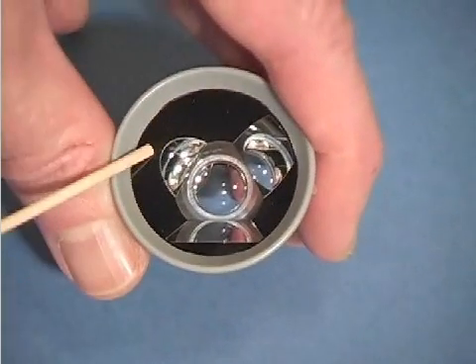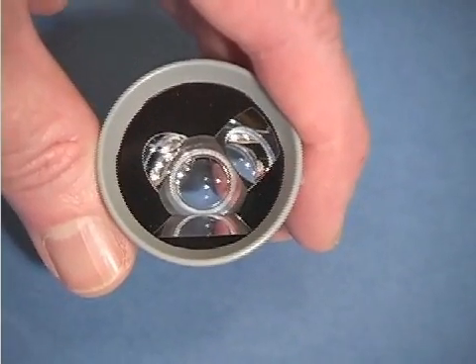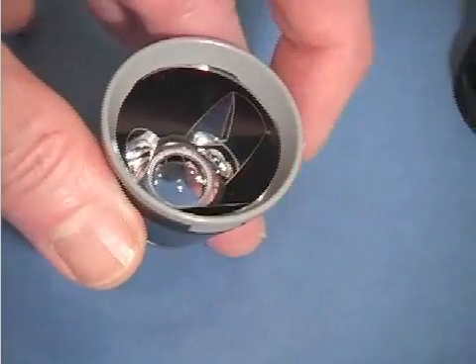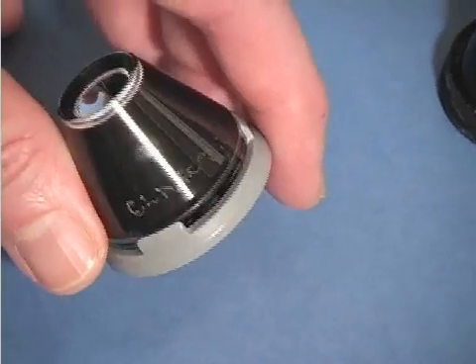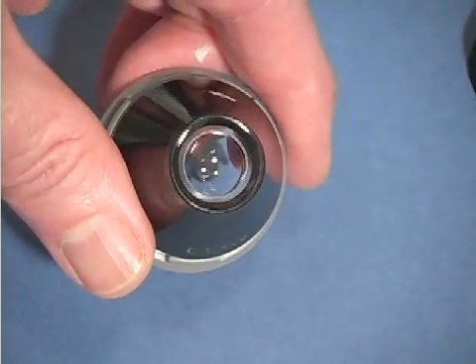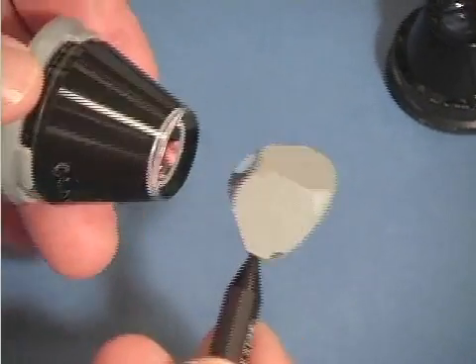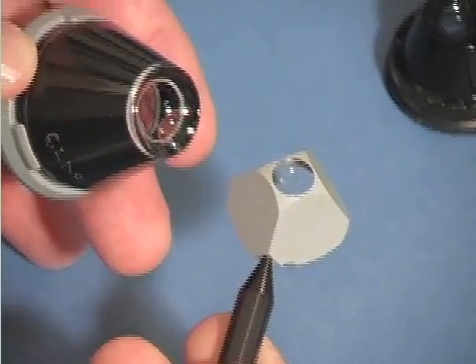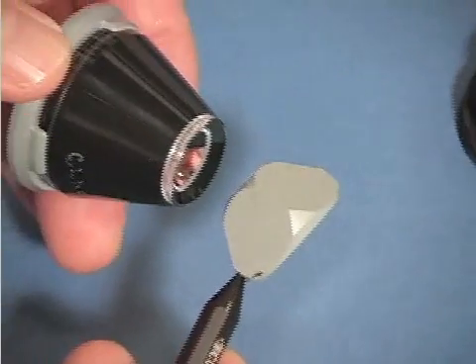This section will discuss the Goldman lens and variations of this lens, such as the MagnaVue lens, the Rich lens, etc. These lenses provide a beautiful view of the iridocorneal angle. They have a large area of contact and vault over the cornea. Because of this, they need to be filled with a methylcellulose coupling solution.